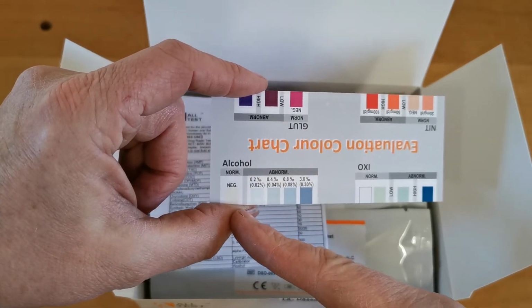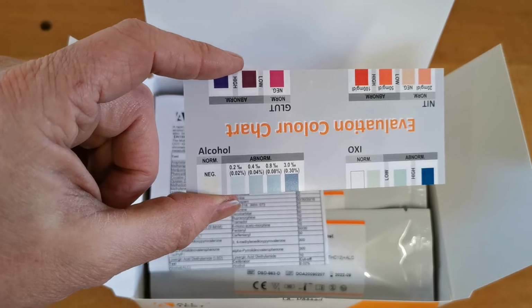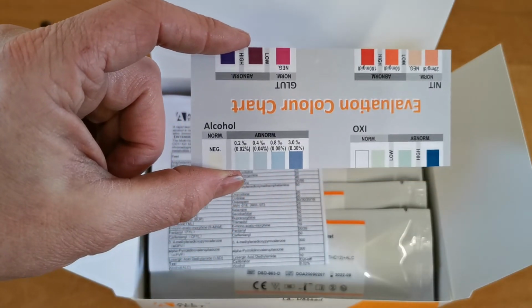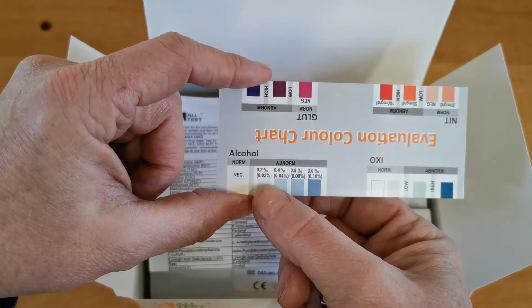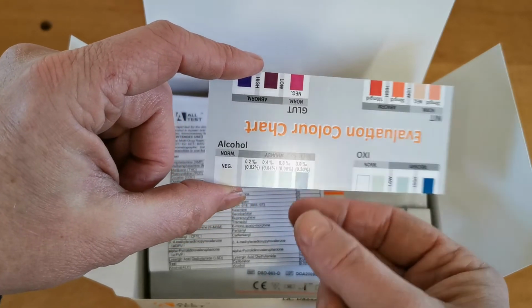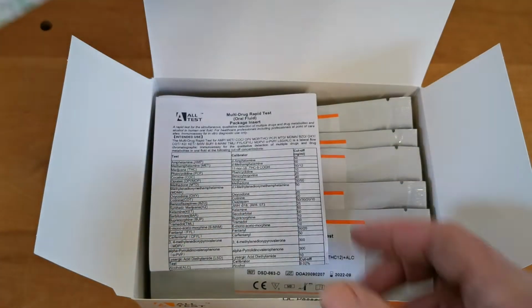There is no change in the actual background membrane colour, and then the variations on this blue discoloration indicate the various levels, and it's basically a colour match against the nearest code for your level indicators on alcohol. At 0.02 your lowest indicator, 0.04, 0.08 and 0.3 and above. Okay, that's percentage BAC equivalents for saliva alcohol readings.